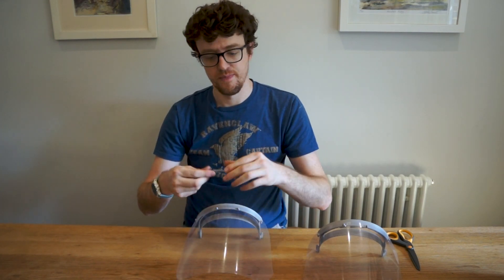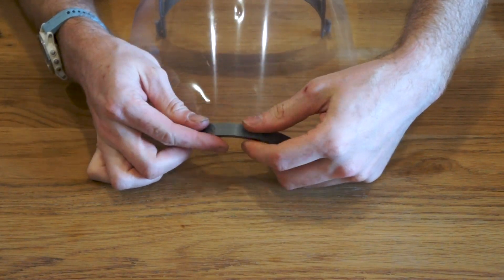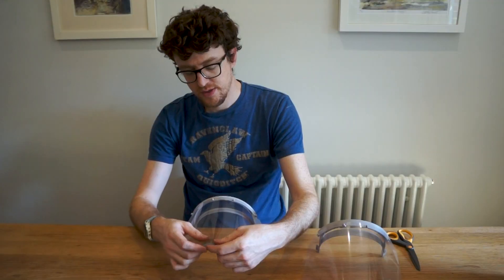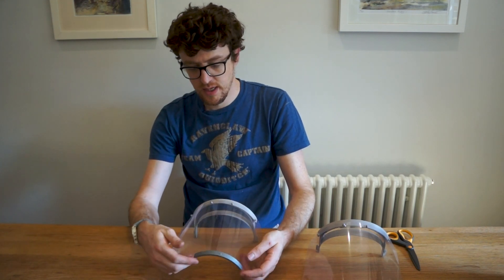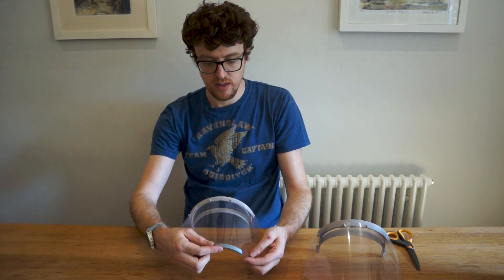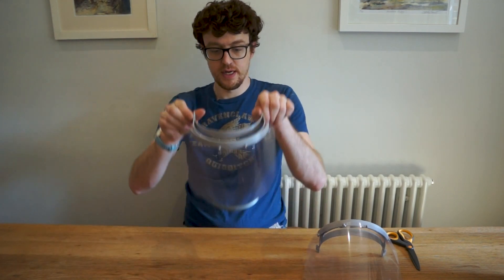Next you need to put the reinforcement part on. That just slides over — it's a resistance fit — so you slide it in on one corner and then work your way around to the other side. As you can see, that's not quite on straight, so just slide it along to the middle, and that's complete.